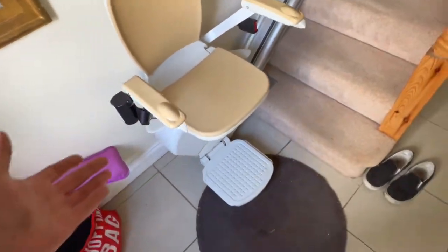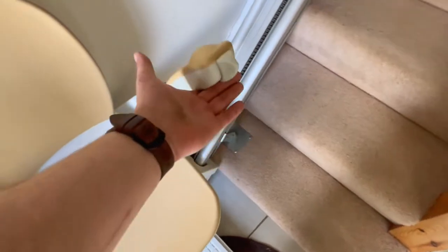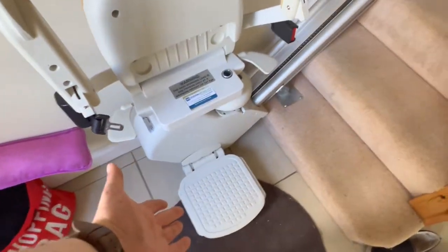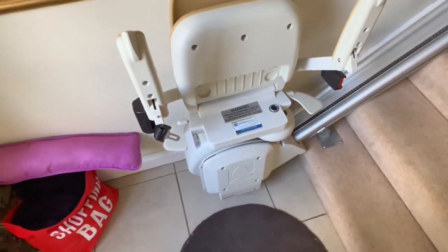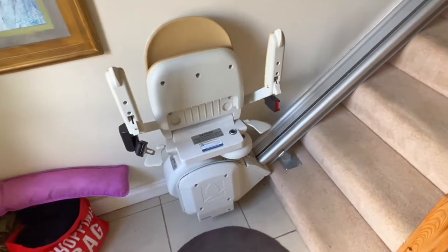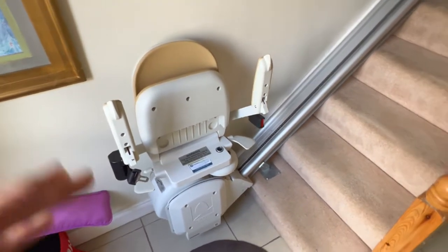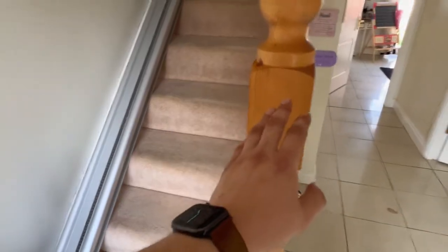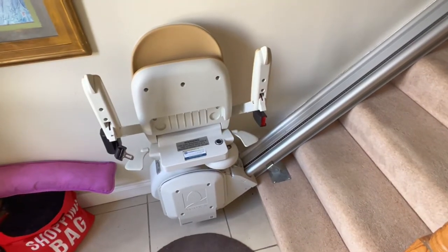To fold it up you lift up the armrests, lift up the seat, and you can lift the footrest up with your hand or use your foot — and that's it, stowed for the next time it's to be used. There are also remote controls for these stair lifts: one you'd usually have hanging here and one at the top of the stairs, for the user to call the stair lift up or down.